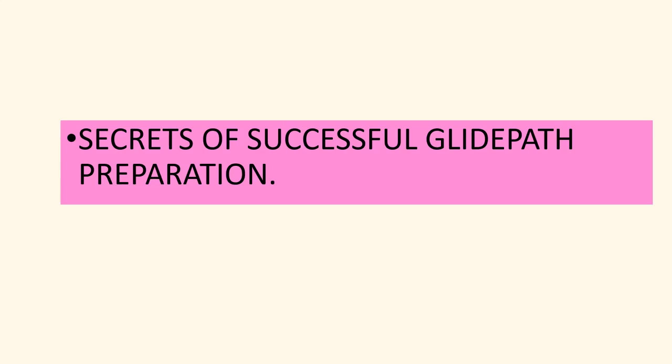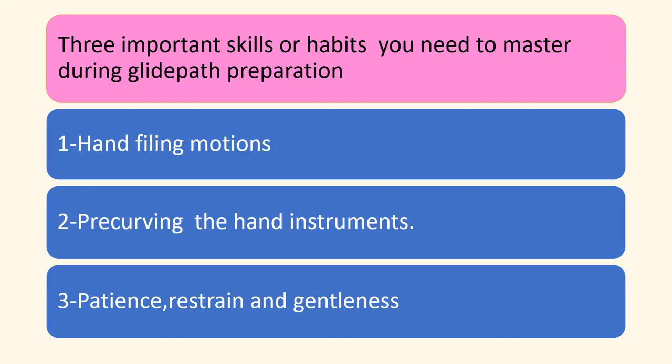Secrets of successful glide path preparation. According to my opinion, these are 3 important skills or habits you need to master during the glide path preparation. First is the hand filing motion. Second is pre-curving the hand instruments. And third is patience, restraint and gentleness.